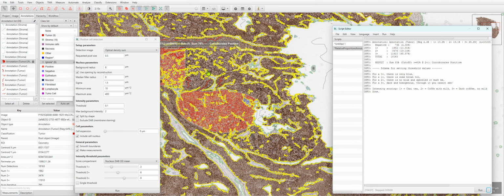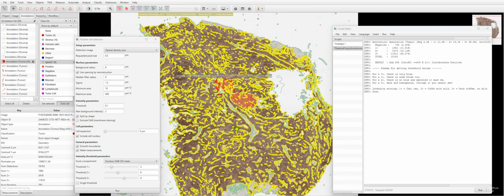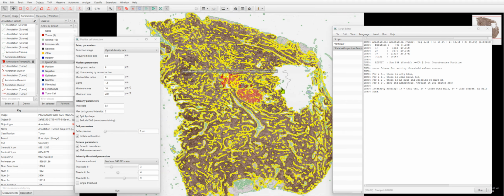You know, the other one was 86, this is 85, it's fairly close. I can do this anywhere on the tumor, or I can do the entire tumor cell field, all of the nuclei, and run the proportion script on that. So that's a quick walkthrough on the workflow for evaluating DAB staining in tumor tissue.